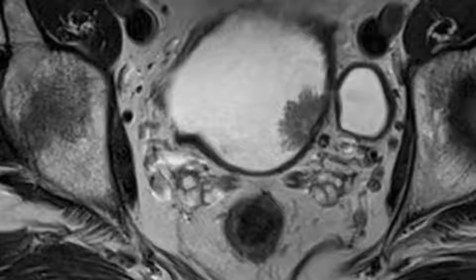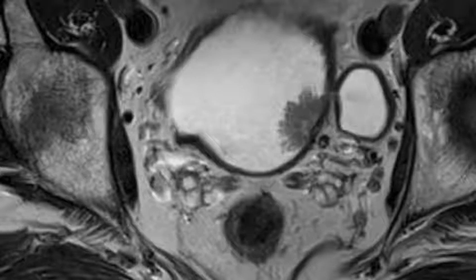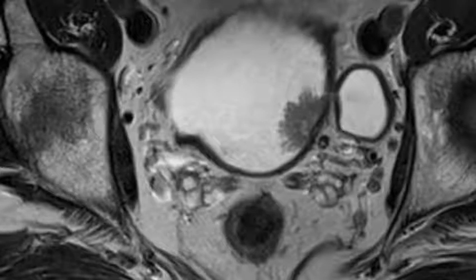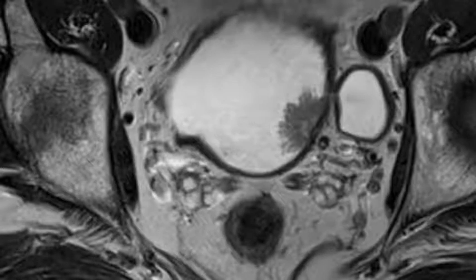T-staging. In patients with known bladder cancer, the important staging question is whether there is muscle invasion, stage T2 or higher. The accuracy of contrast-enhanced CT in the local staging of bladder cancer is only 40 to 60%. MR imaging is considered superior to CT in demonstrating the extent of bladder wall invasion.